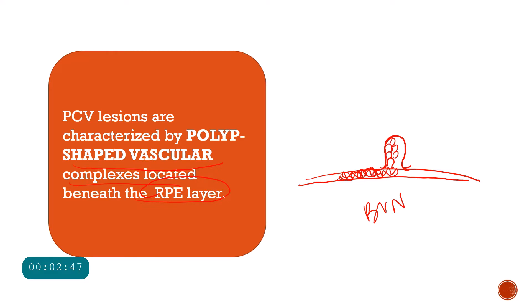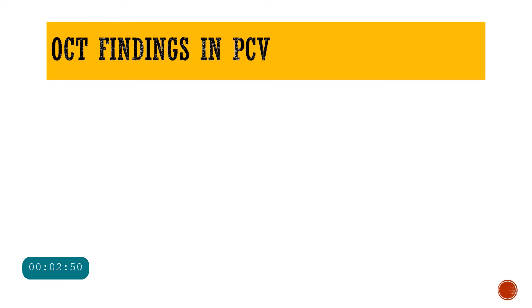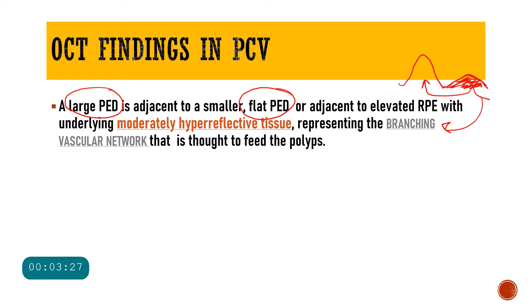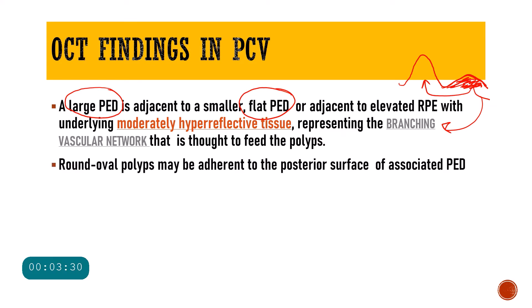On OCT, PCV will typically present with a large pigment epithelial detachment. Adjacent to that large PED, there will be a smaller or flatter PED which will usually contain hyper-reflective material — that tissue is the branching vascular network. This smaller PED housing the branching vascular network is considered to be supplying the polyps present in that tall PED. Sometimes on the posterior surface of this PED you will see certain round oval polyps.